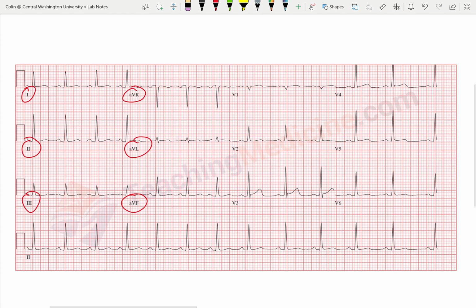If you've ever put a 12 lead on, the stickers that are V1 through V6 are actually on a separate strand that you have to click into the 4 lead box. If you don't know what I'm talking about, don't worry about it. But you're always going to put a 4 lead on before you put a 12 lead on. So you might as well print out a strip.